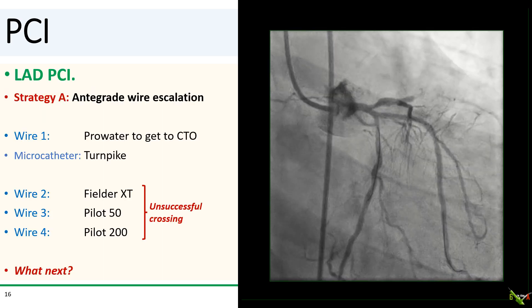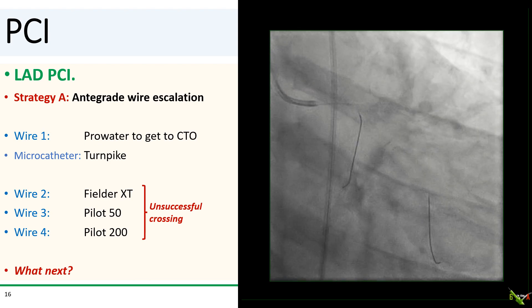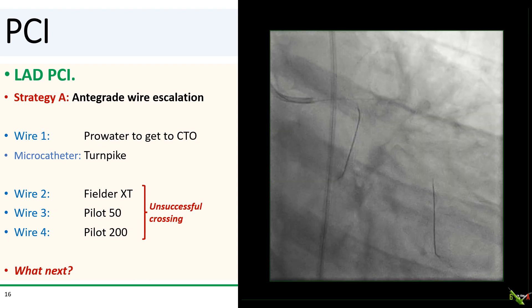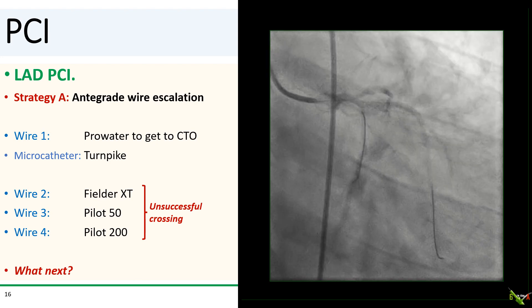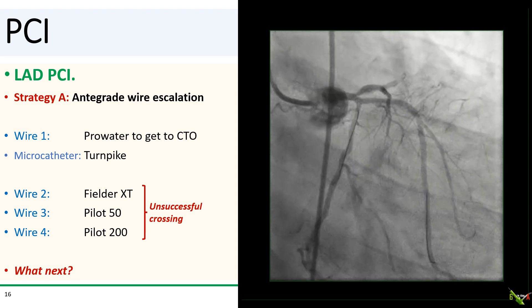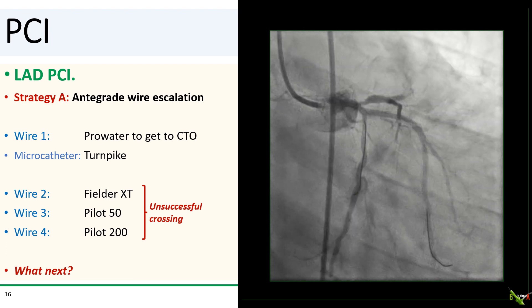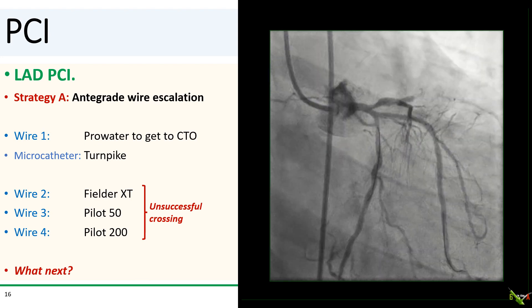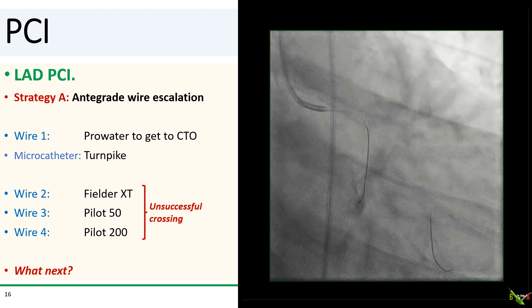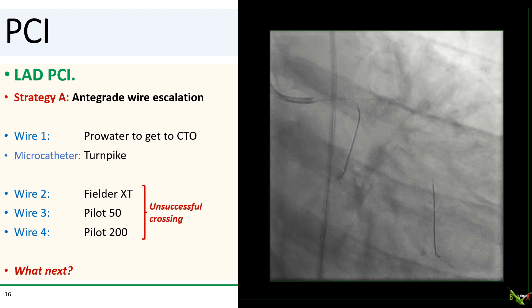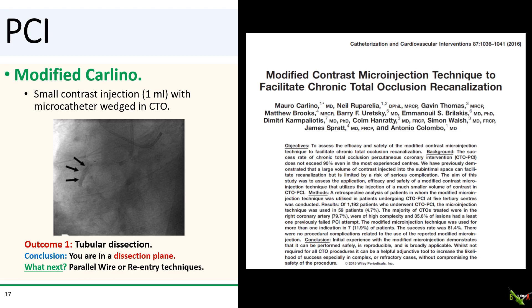Now on to the main course — the LAD. Our plan called for anterograde wire escalation. We used a Prowater wire to get a Turnpike microcatheter to the CTO. Thinking there might be a microchannel, we first used a Fielder XT wire to probe the CTO, but without success. We moved up to a Pilot 50, which was similarly unsuccessful. A heavier Pilot 200 wire couldn't cross either, although it did penetrate the proximal cap and entered perhaps halfway into the occlusion. Should we go to dissection re-entry, or switch to Gladius Mongo and knuckle around the CTO and re-enter? I actually decided to try the modified Carlino technique first.